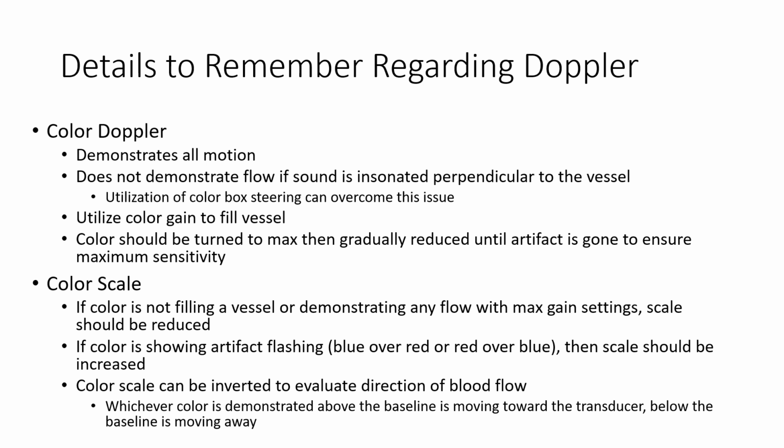And we can use those to differentiate between arteries and veins, even if we happen to see one that's flowing toward, maybe a leg vein that's flowing toward the heart or toward the transducer, but we still want it to look blue. We could invert a map like that.